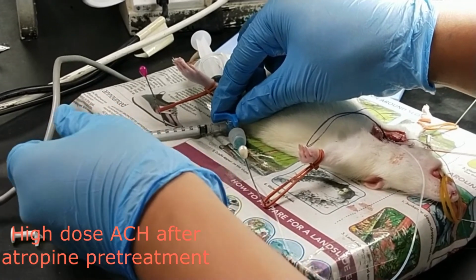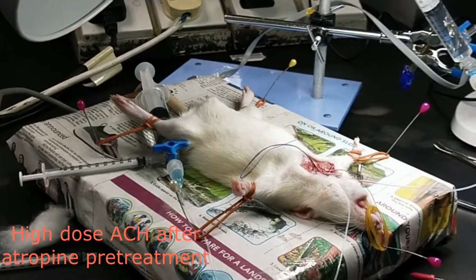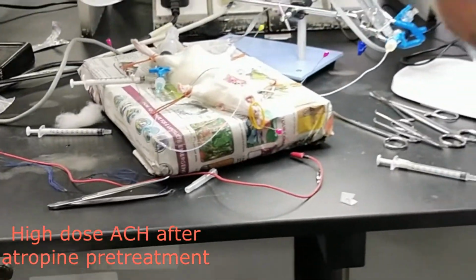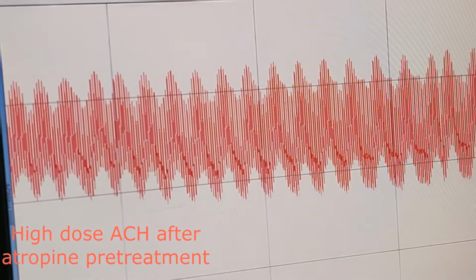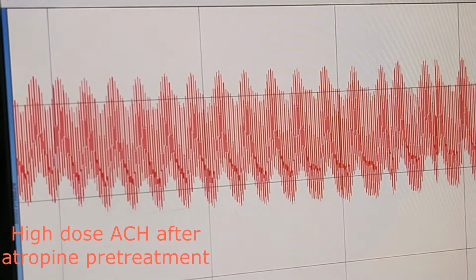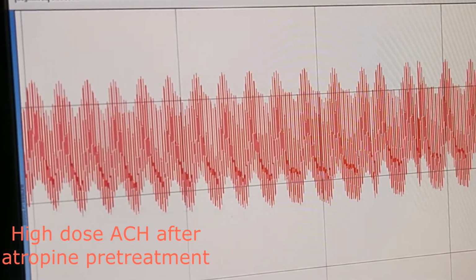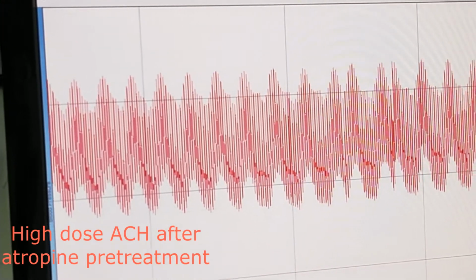After the injection, we need to check the blood pressure, whether it's increasing or decreasing. After the injection of 1 mg per kg of acetylcholine, you can see that there are no changes in terms of blood pressure, because the atropine already blocked the activity of acetylcholine.